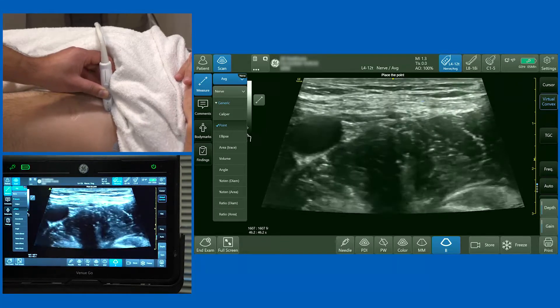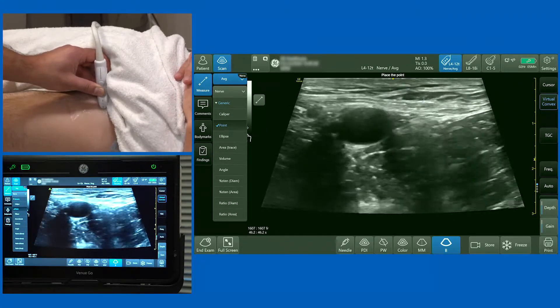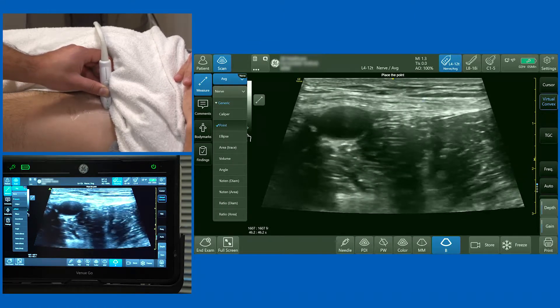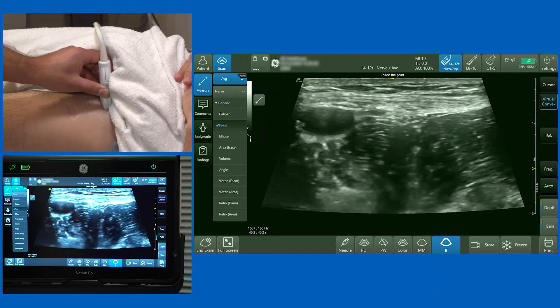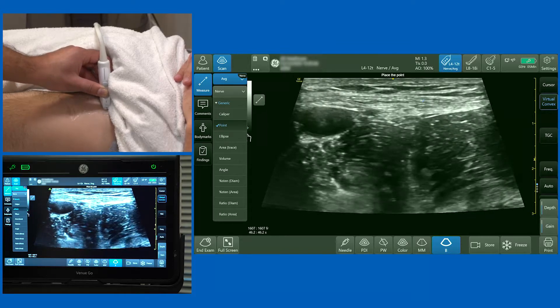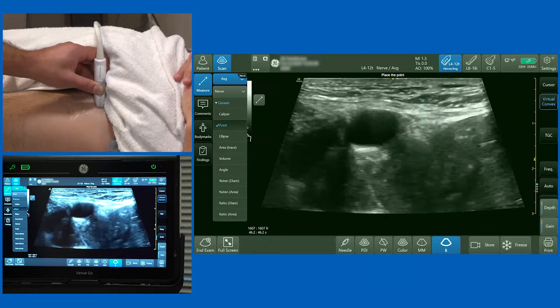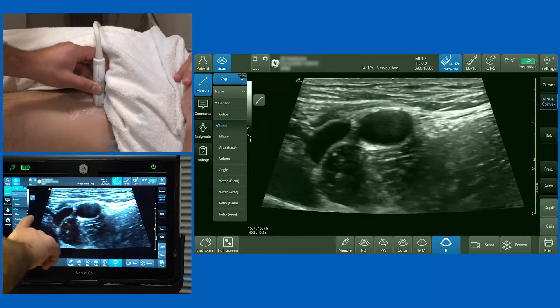Now I'm going to slide the probe towards the midline. As I come towards the midline, the first thing I want to observe is the femoral artery — a circular, hypoechoic, pulsatile, and non-compressible structure. If I slide the probe slightly more medially, you'll see the femoral vein become visible.